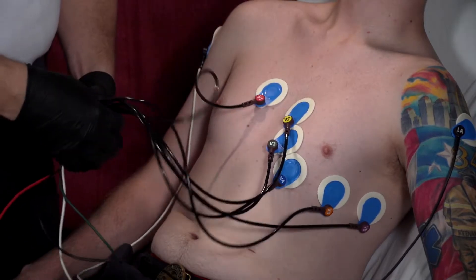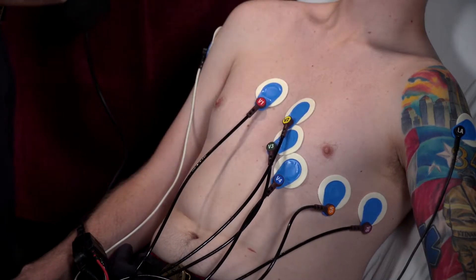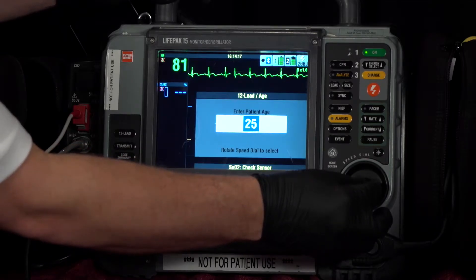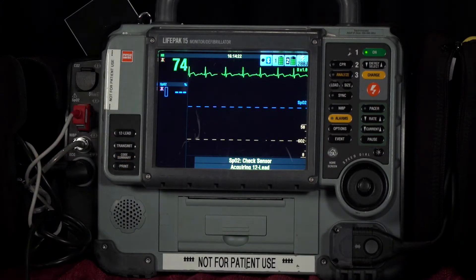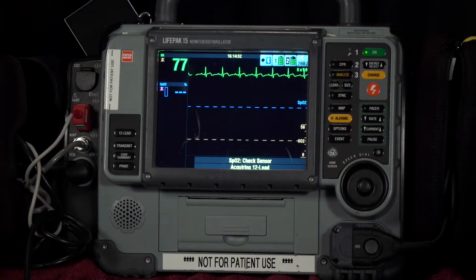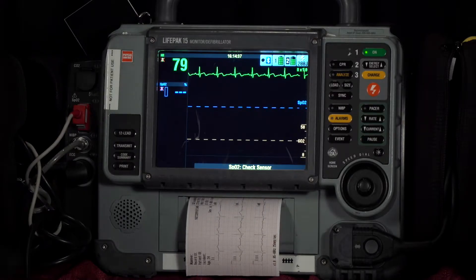Once we have our limb leads attached, we'll obtain our first 12-lead EKG. Press the 12-lead button, scroll to the patient's age, enter the patient's sex, and the 12-lead is automatically going to run. Remind the patient to stay still for about 30 seconds — try not to move, try not to tense up — so that we get as clean of an EKG tracing as possible. Once it's analyzing, it's going to print out that 12-lead EKG.